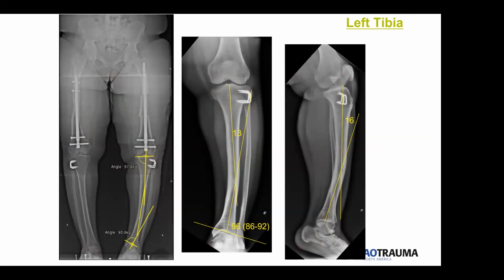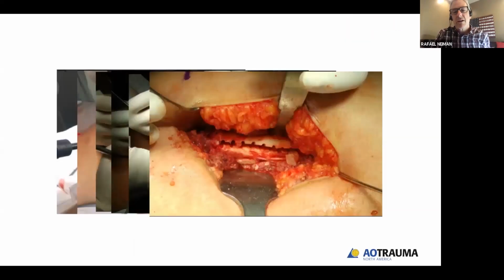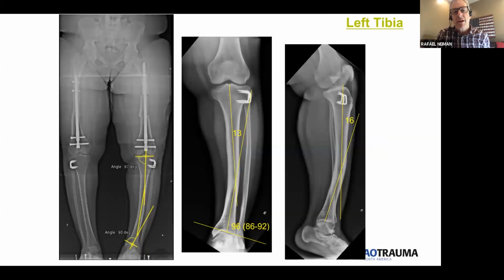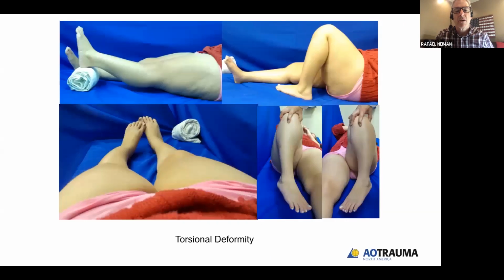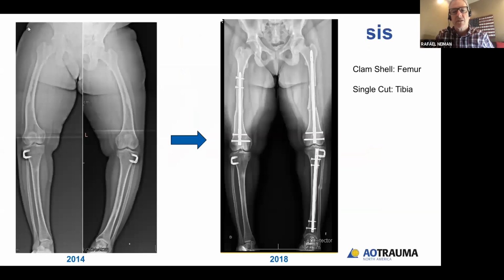So now back to Sean's comment again about a single CORA, you saw initially that there were multiple deformities, even to the tibia here and here, and they resolved it into a single one, which is within the bone. So that tells you that it can be corrected with now a different type of osteotomy. So she does have torsion. That doesn't mean you can't correct that with a single cut.